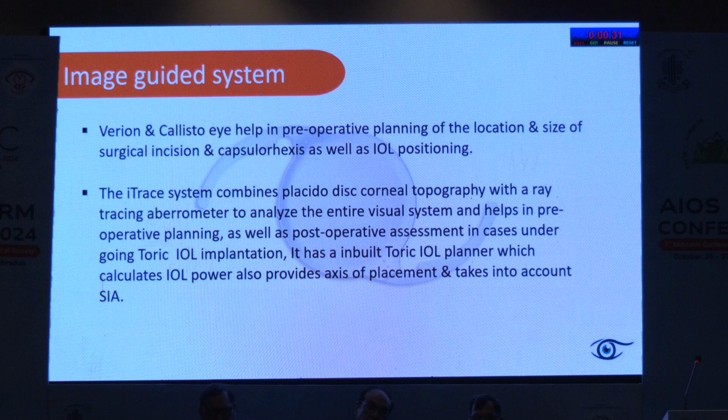Then we have the iTrace, which combines placido-disc corneal topography, and it will help us with preoperative as well as postoperative assessment in cases undergoing IOL implantation. It also has an inbuilt toric planner, and it helps us to calculate the power.